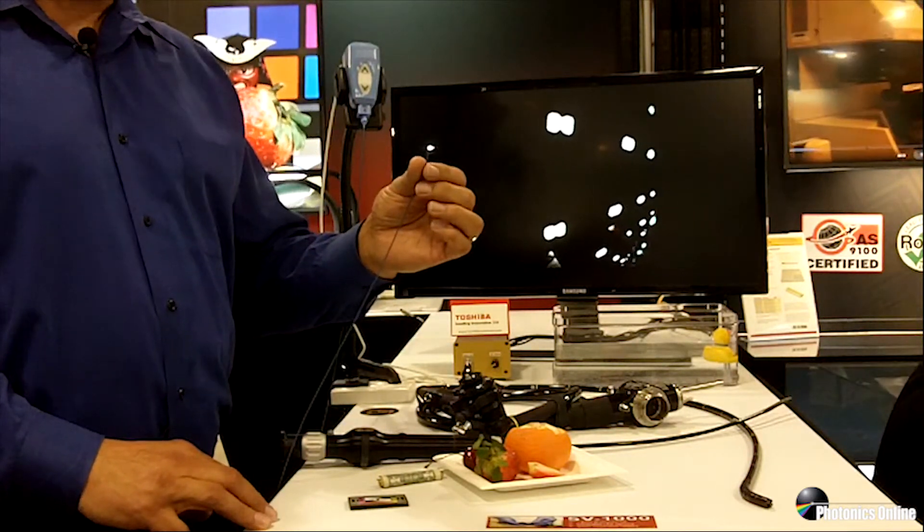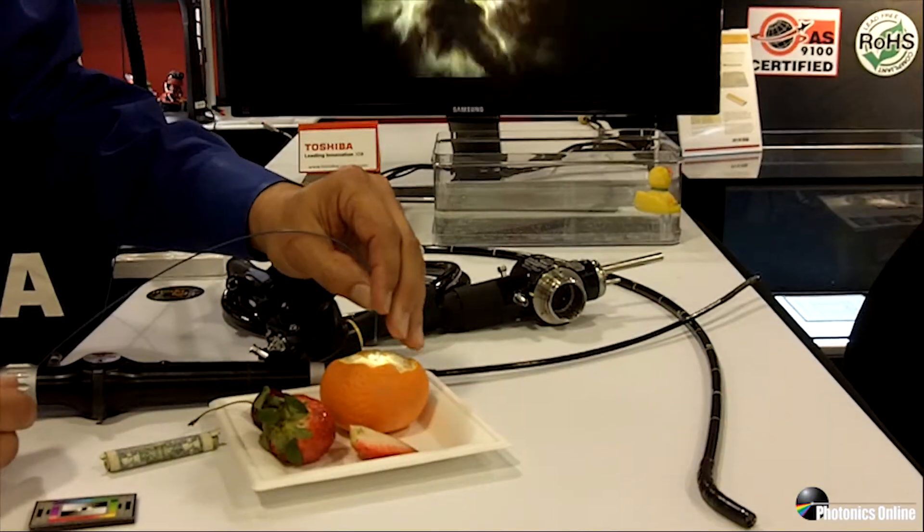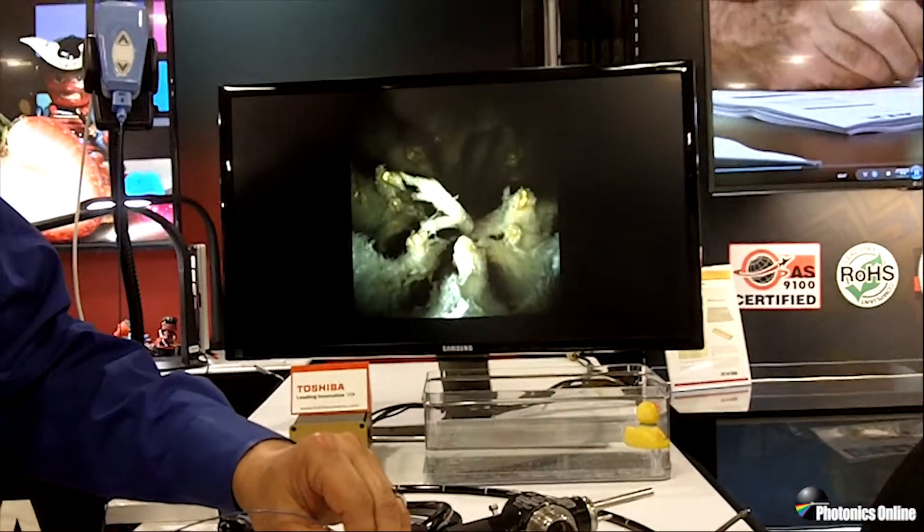Let me show you some of the image advantages from the SV-1000. Here are some imaging examples to showcase the incredible details that you can see. It features a 1 millimeter by 1 millimeter sensor, 400 by 400 pixels, a 120 degree field-of-view lens, and a working focal distance of 5 to 50 millimeters.